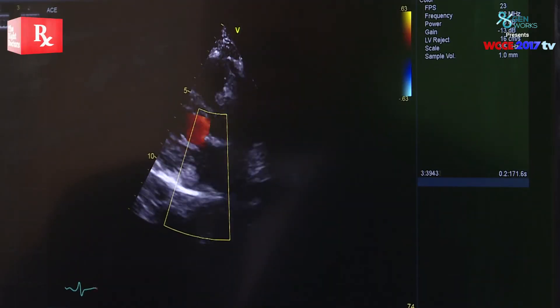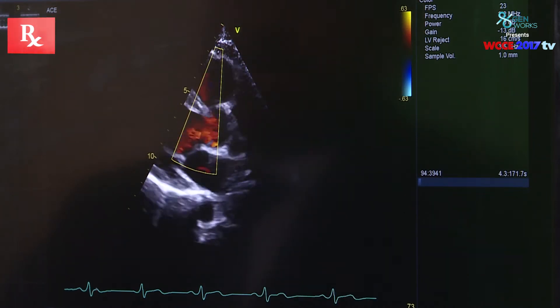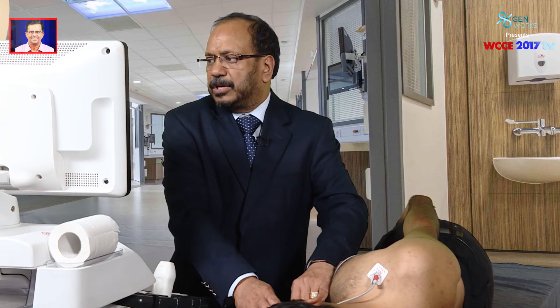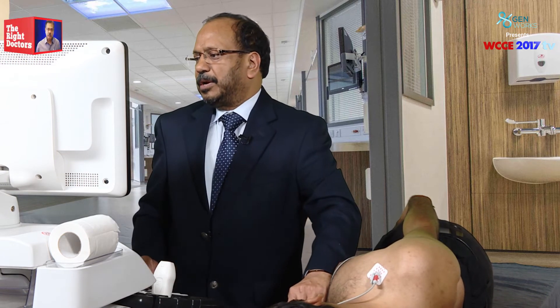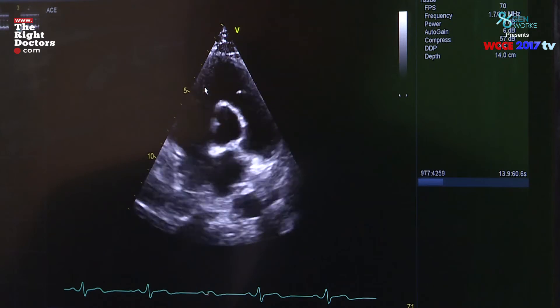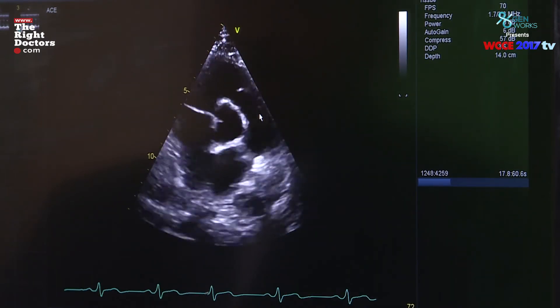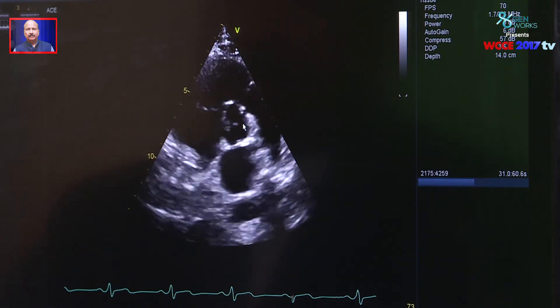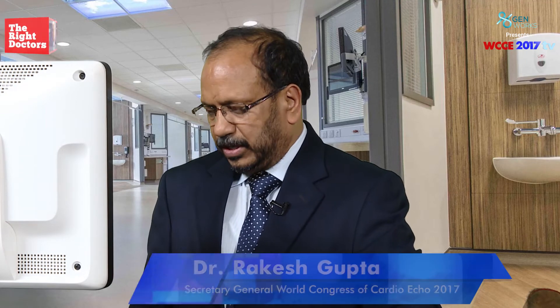The third aspect is switching on color Doppler to look at the turbulence across the aortic valve. In this subject there is hardly any turbulence across the aortic or mitral valve, suggesting no aortic stenosis. We then rotate the transducer clockwise — with the aorta in the center, LA, RA, tricuspid valve, RV outflow tract, and pulmonary artery dividing into right and left branches. In this short axis view of the aortic valve, planimetry is not reliable due to poor co-relationship with catheter studies.